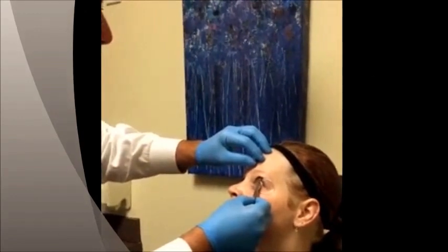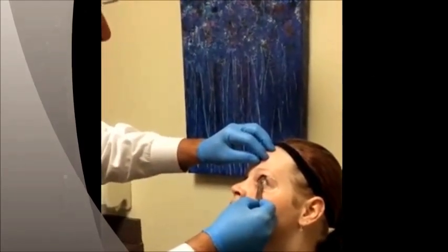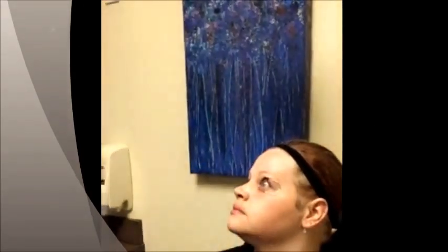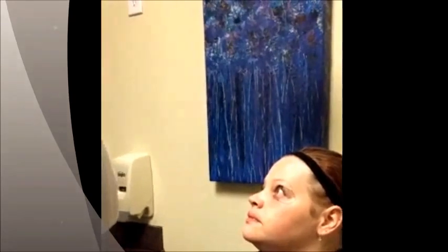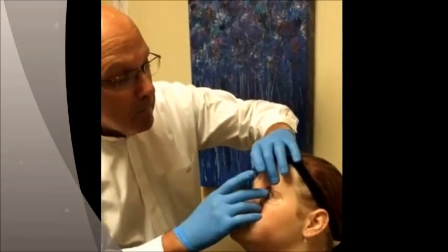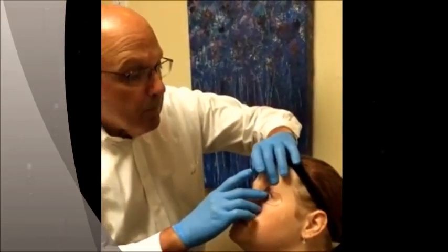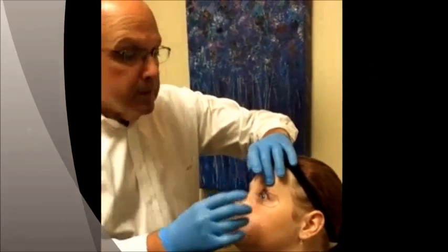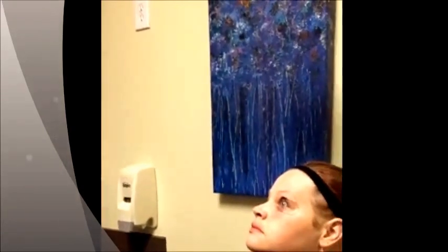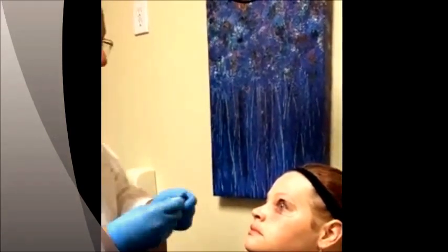You can see I'm placing the membrane and using the forceps to press it onto the surface of the eye. I then come back with a second surgical spear and press the membrane again. If I'm happy with the way the membrane is positioned, I put a contact lens on top to keep the membrane fixed. I ask the patient to come back five days later, and then I remove the contact lens from the eye.